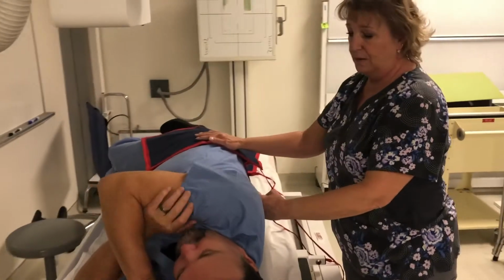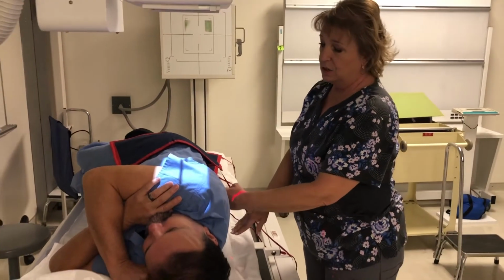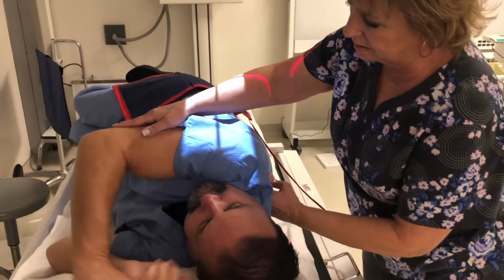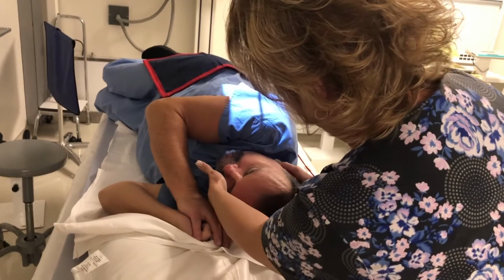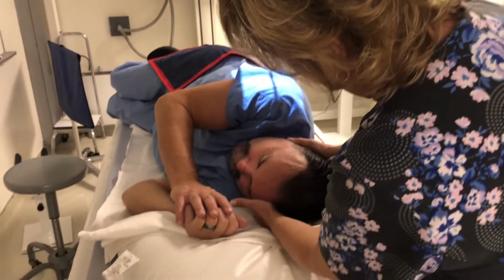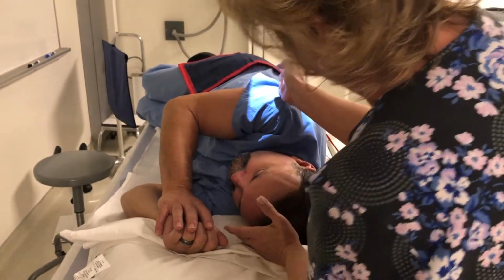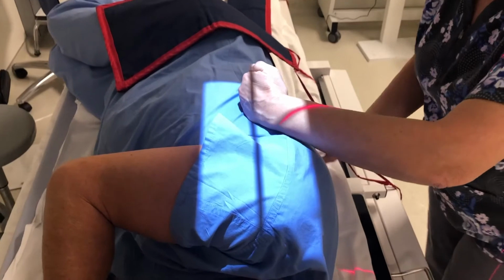It's just off of lateral, about 20 degrees, and I'm going to try to center over the spine. Make sure that his hands aren't in the way, and if his head is aligned with his body, I can gauge where his spine is, and I'm just going to be centered over his spine.